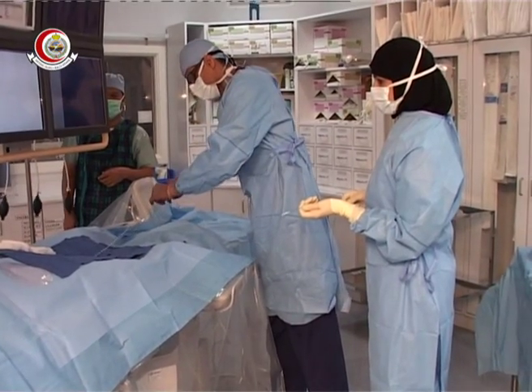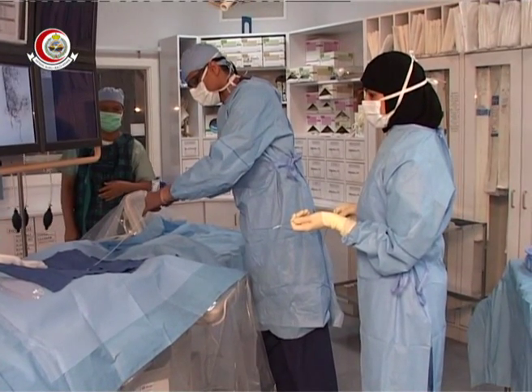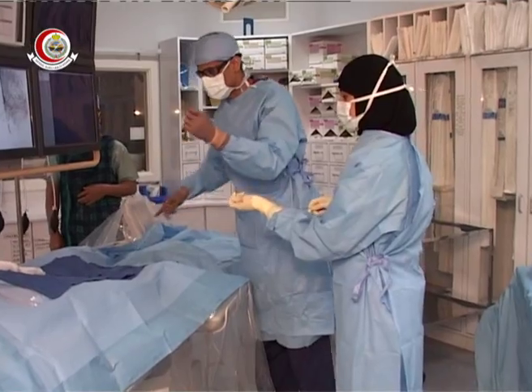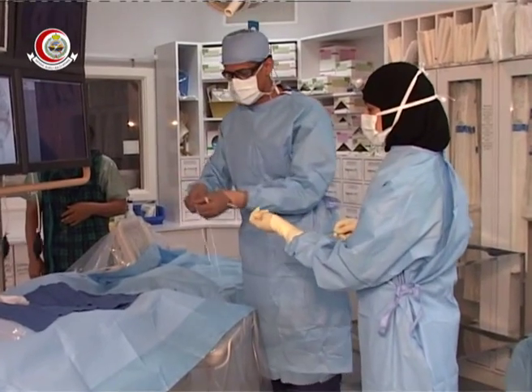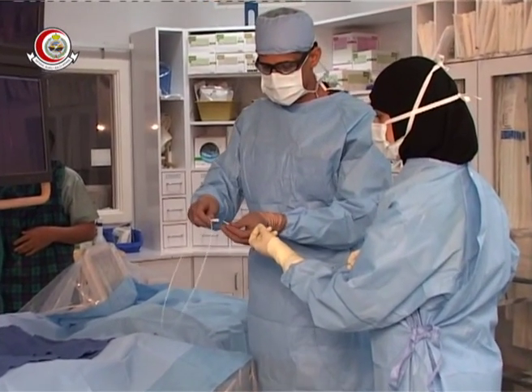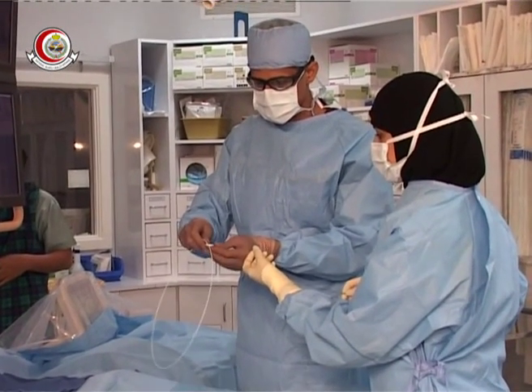The procedure is performed inside the angiosuite by the doctor, accompanied by the technologist, angionurse, and the anesthesia team.